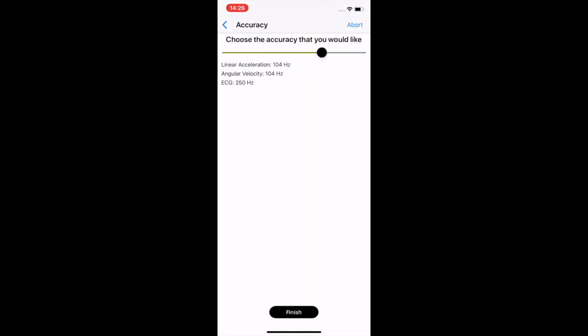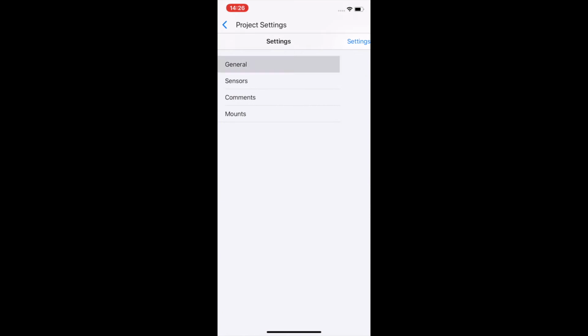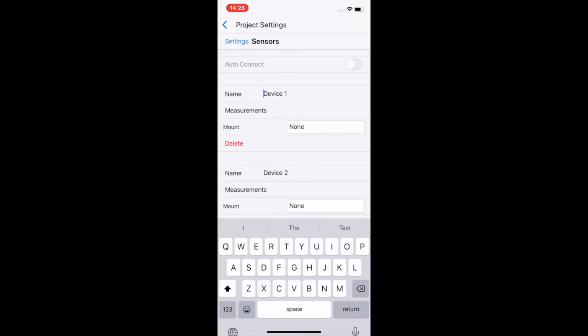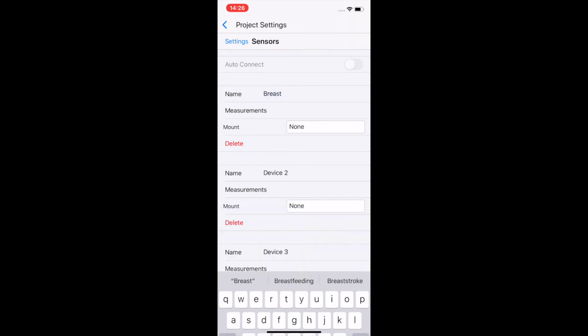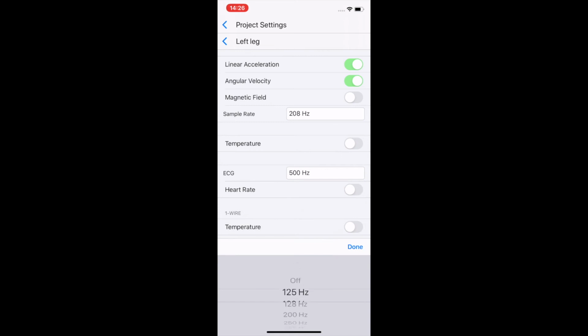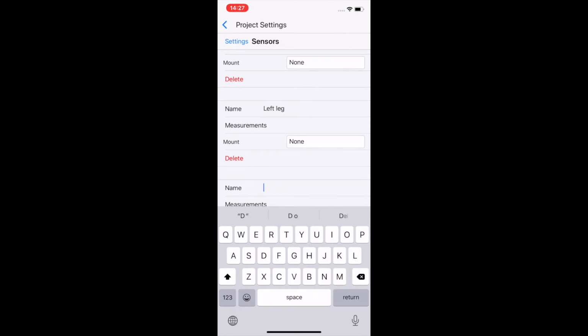So now we continue. We like to choose the heart rate. Because we don't want the legs to send us ECG data, we go into the sensor data, rename them, and give them a little bit more additional information. For the breast belt, we take linear acceleration and gyroscope away and name it breast, and the other parts, the left leg, and then we go into the measurements. We take ECG off, so we don't need to get that data from there, and we take the right leg as well.